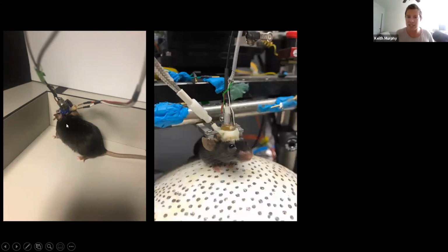So here you can see I'm going to compare. This is an experiment where I'm using LFP recording. Here you can see these electrodes running wires into the brain. Here's my ultrasound emitting element, and here's a fiber to collect optical information. A lot going on here. But way on the left here, you can see a little head bracket. And here you can see the animal's head is kind of strained from all the weight of these different components. You can still do it, but the alternative is to take this head bar that you can see here. I'll actually just draw on the image.